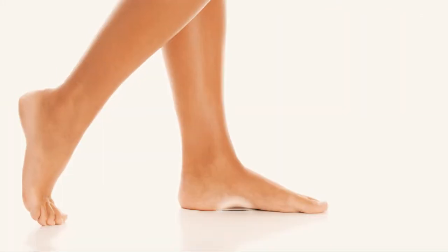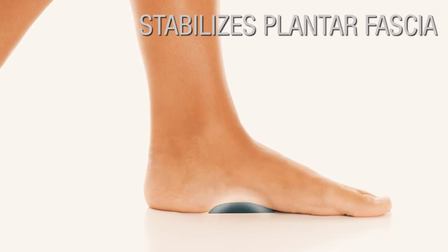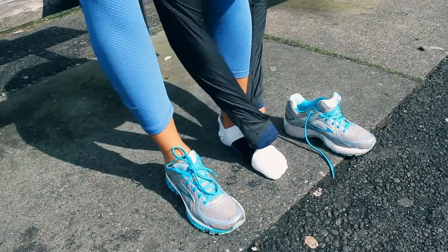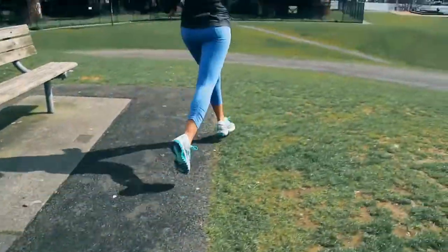This wrap provides upward compression to the arch, stabilizing the plantar fascia to reduce further tearing and expedite the healing process. Unlike insoles or orthotics, the Arch Pro-Tech fits to your foot and can be worn with any shoe.